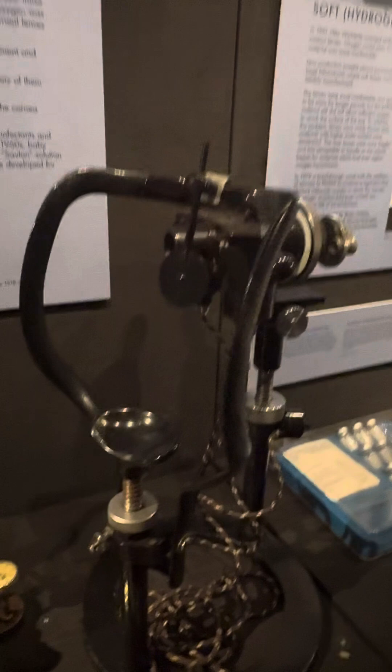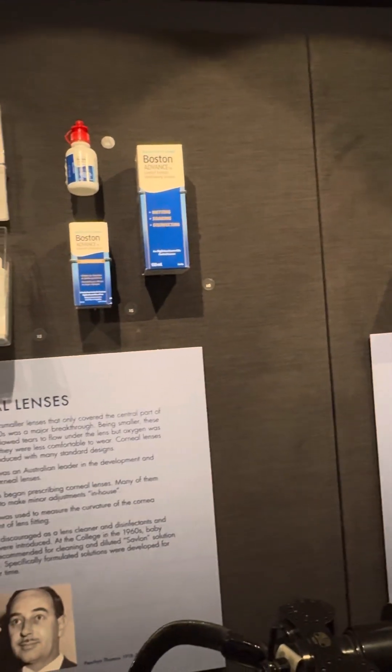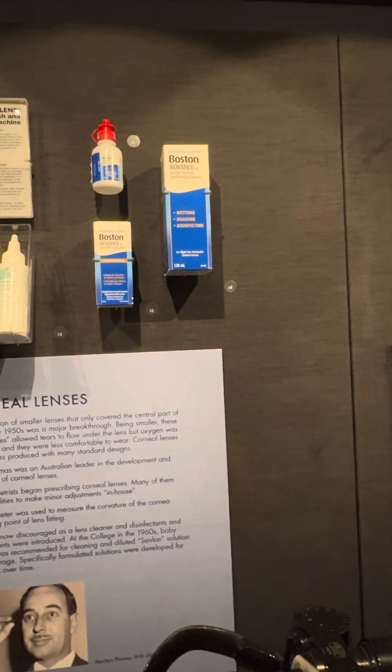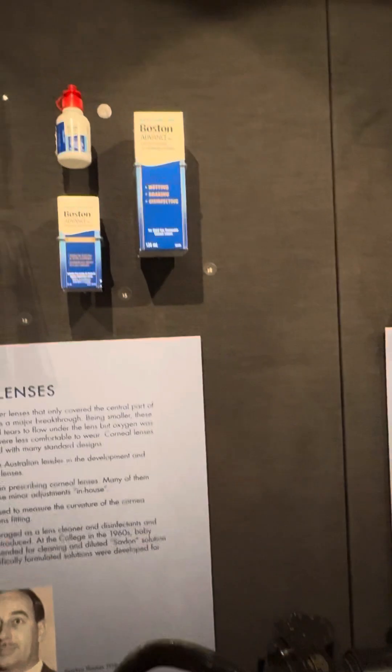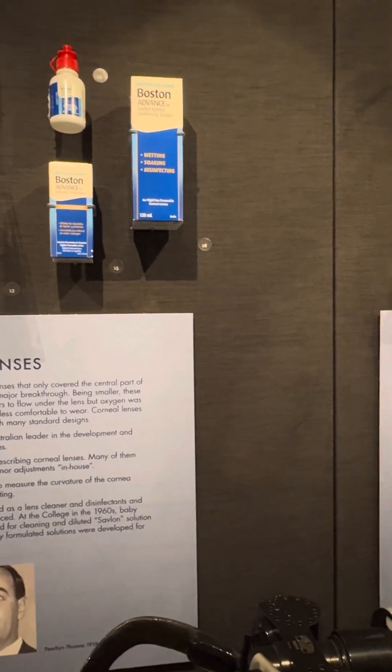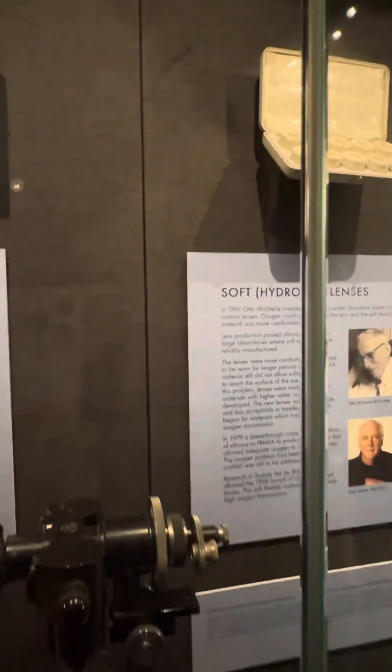Here are some of the cleaning products used with lenses. This one here I'm using is actually for my glasses, not the lenses themselves — but this other one is specifically for contact lenses.